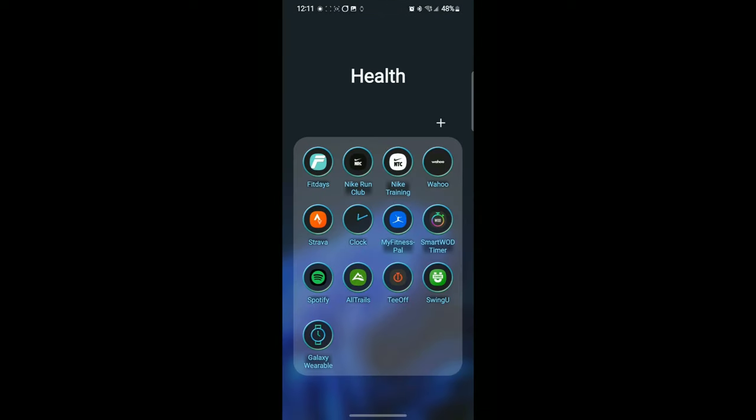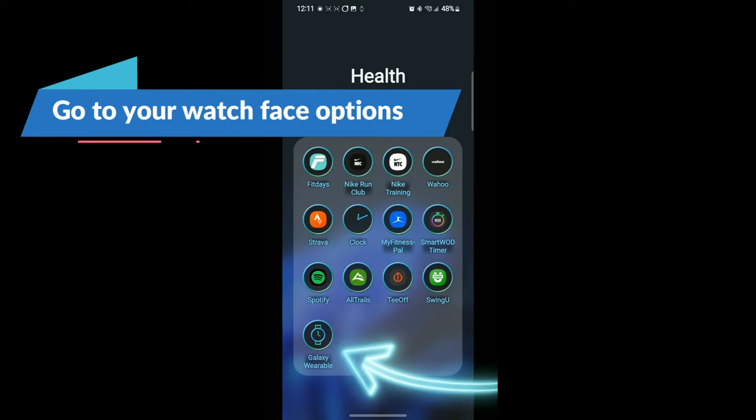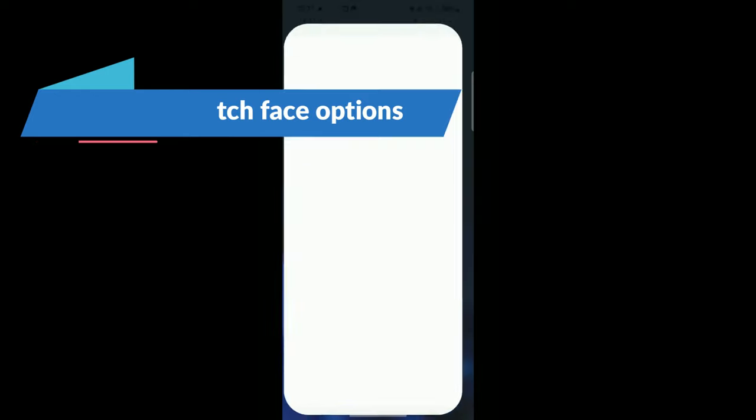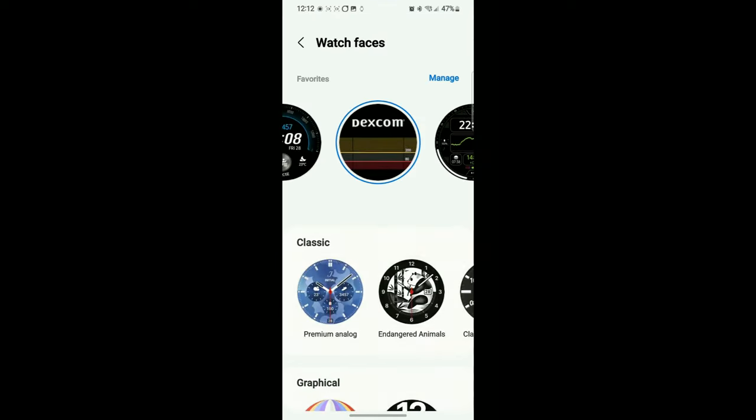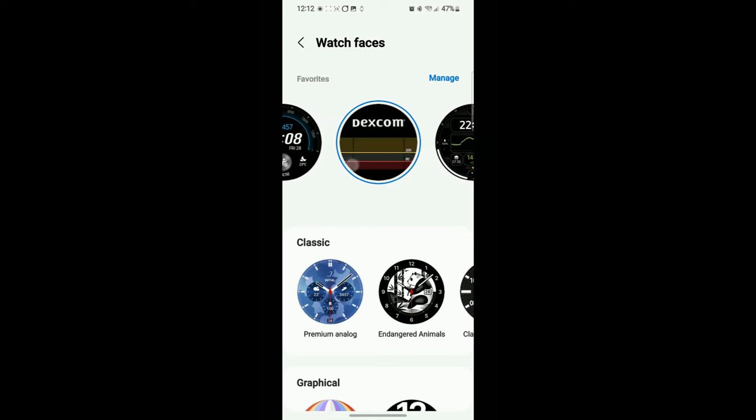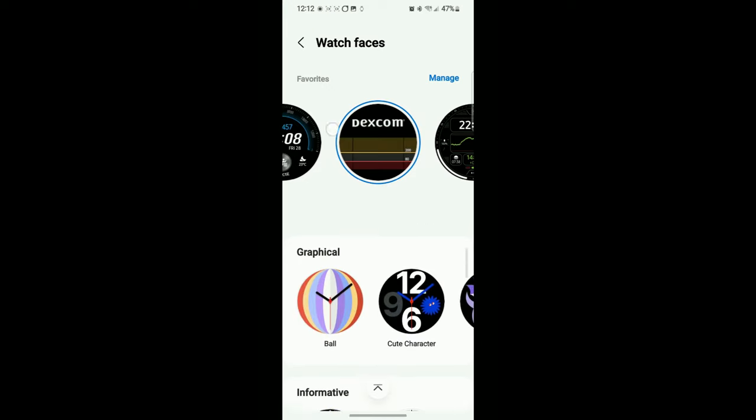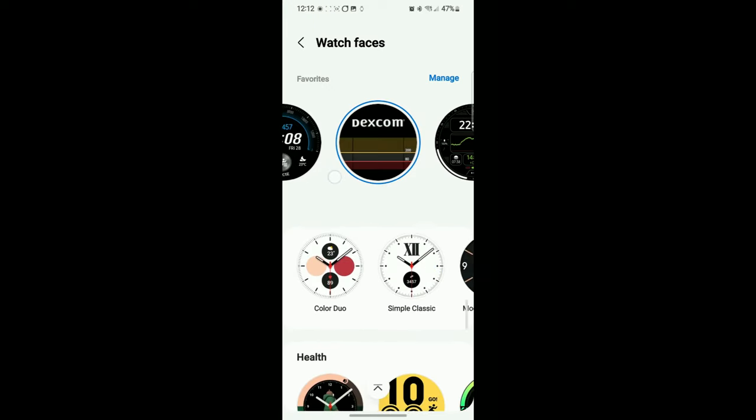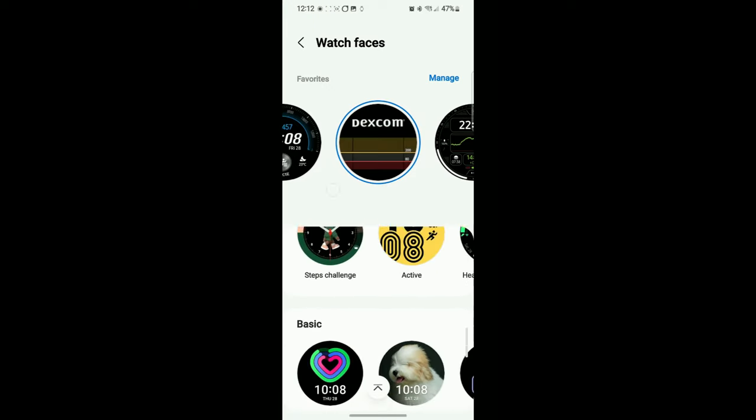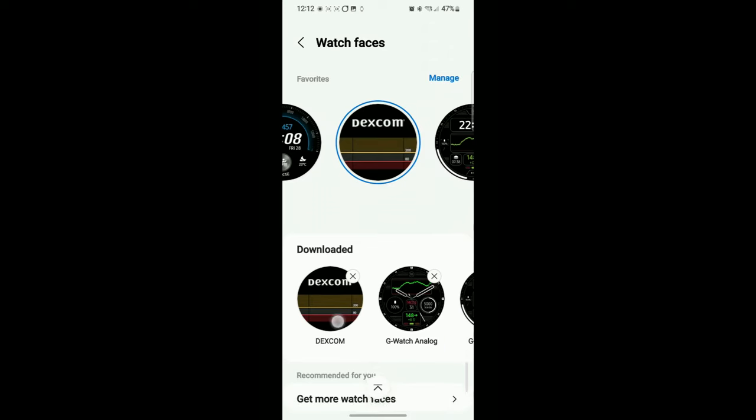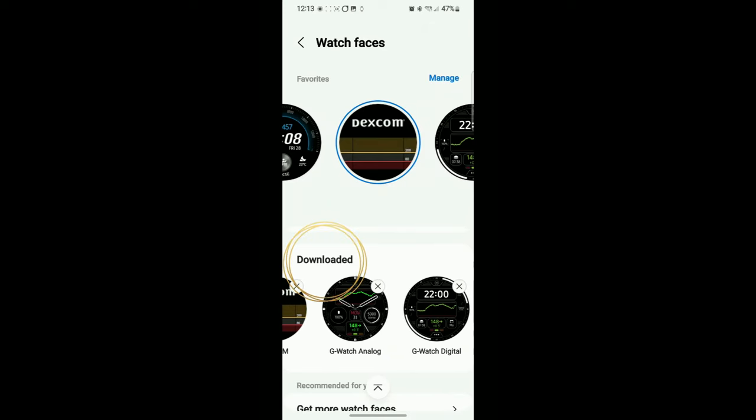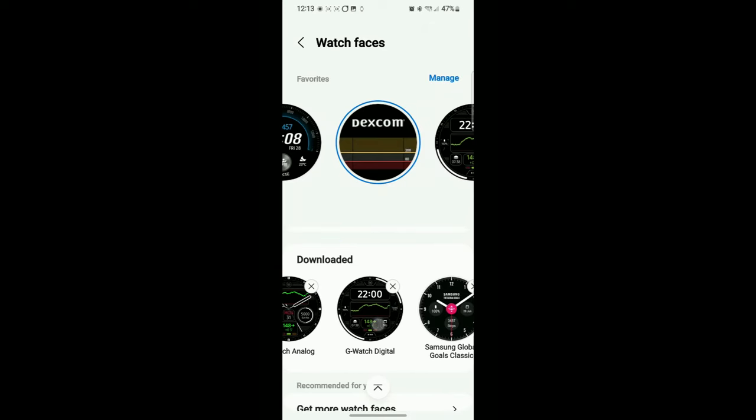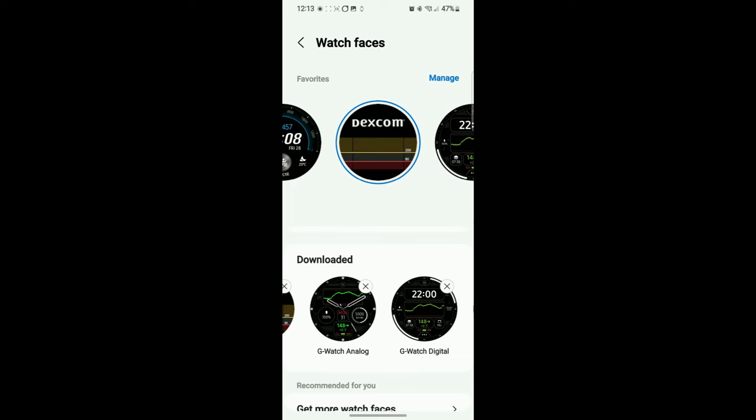Alright, back to the Galaxy Wearable app. This is where you can find all your watch faces. These are the faces I have now. We want to go down to our downloads. Everything we do today will be found and downloaded. As you can see here, there are two new watch faces, but we're not going to use these.